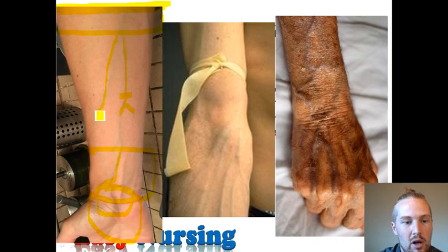I would probably start as far down as I can see, anywhere from here to about an inch from the top, because I want it to be able to sit all the way in. So with this IV, I could start anywhere from here and probably about here. So anywhere in here is good.